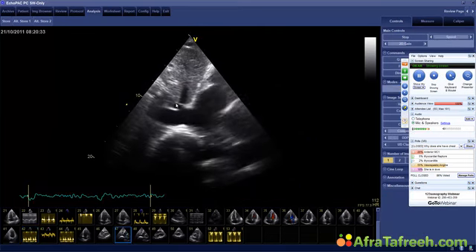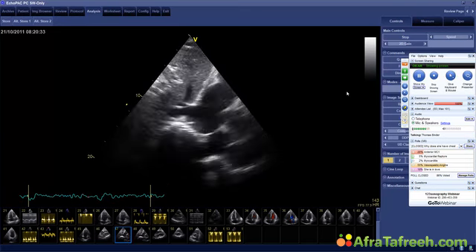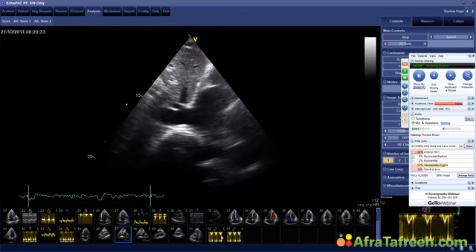Inferior vena cava, something that I try to do as often as possible, and which you should do especially in patients where you have some form of right ventricular disease or where you're looking for pericardial effusion. So the subcostal view, I think, is very, very important.